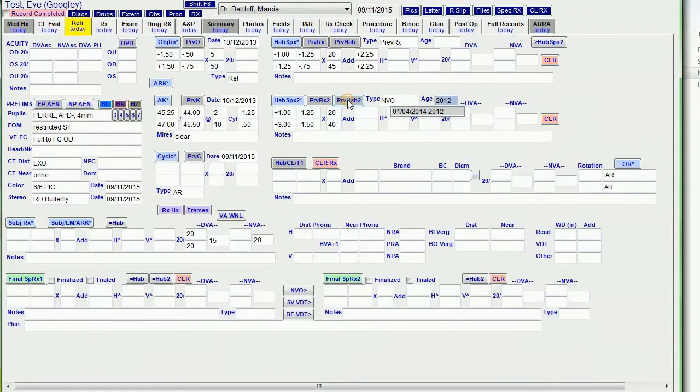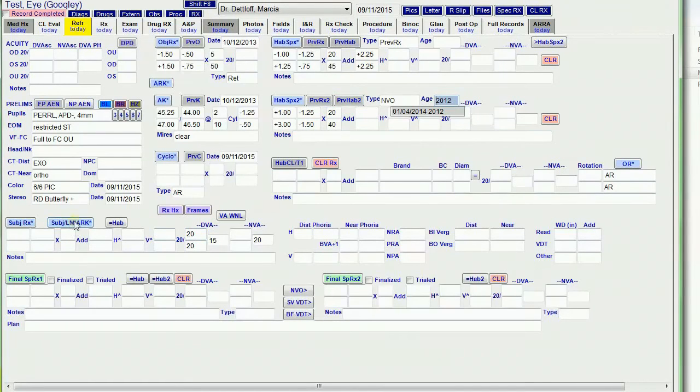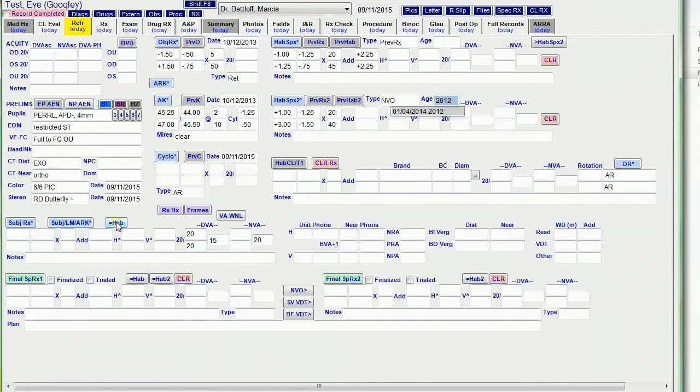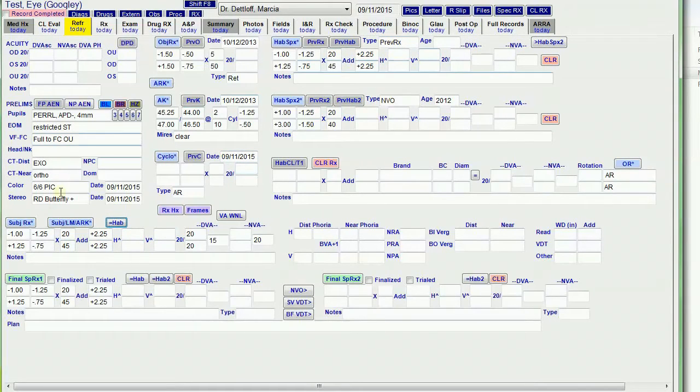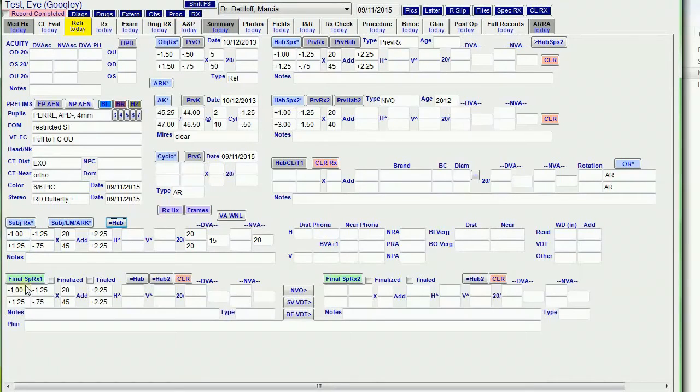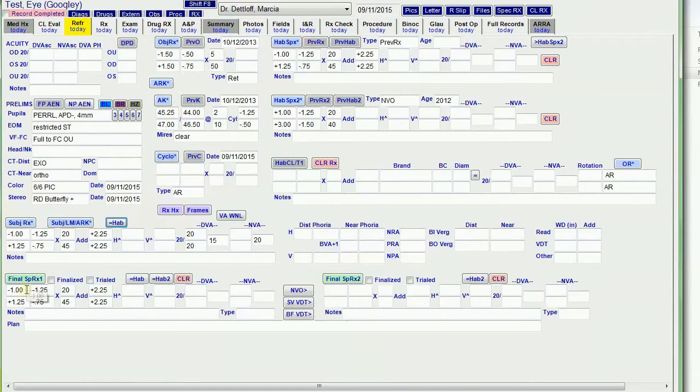I'm going to fill that in with the previous habitual two. And then, since I don't have this hooked up, I'm going to make the subjective equal to the habitual one. So it copies this data into the habitual. And the subjective fields copy down to the final fields.